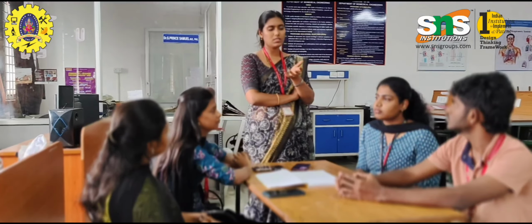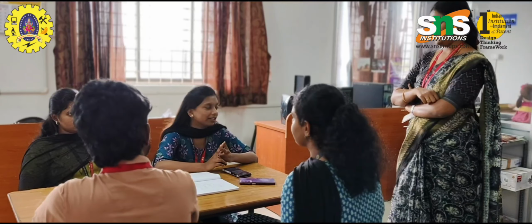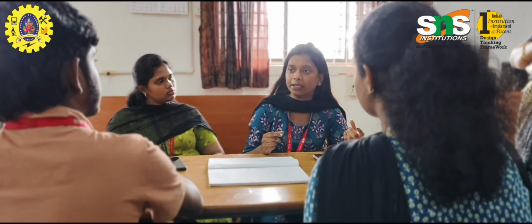Now we will move on to the techniques. I think we have two techniques in the ESU machine. What are those two techniques? One is monopolar and another one is bipolar. In monopolar, from the generator which generates a high frequency current, the current is taken into the patient's body, and through the grounding pad, which is the reference electrode, we take it back to the generator. So this is like one way. Only one active electrode is used in monopolar, which is a traditional method. Here we don't have another electrode to send back the current.